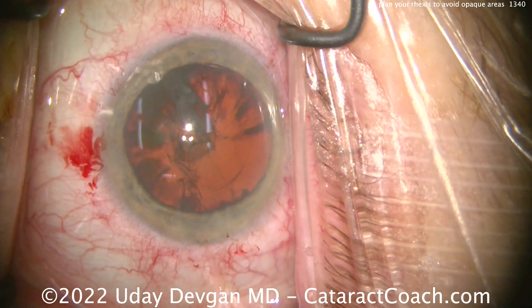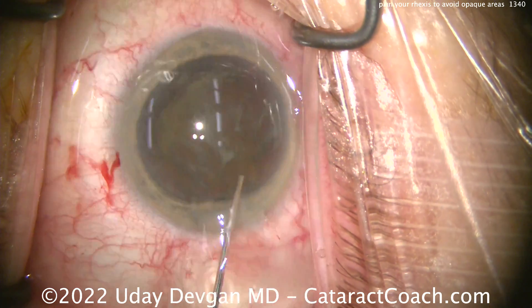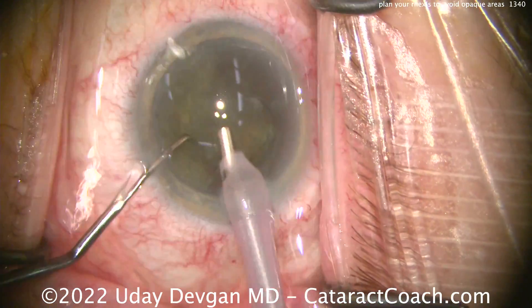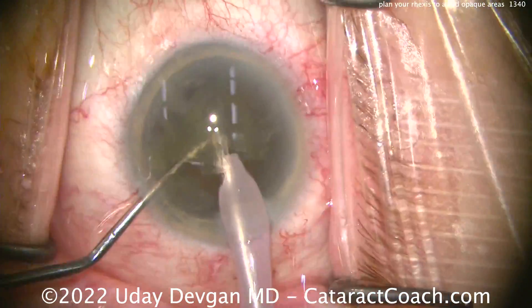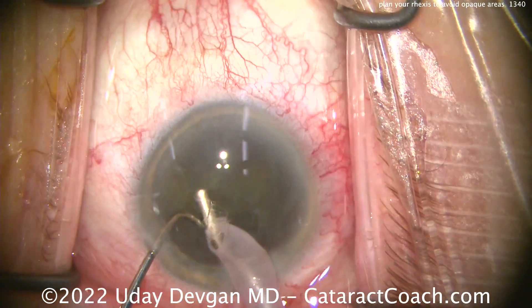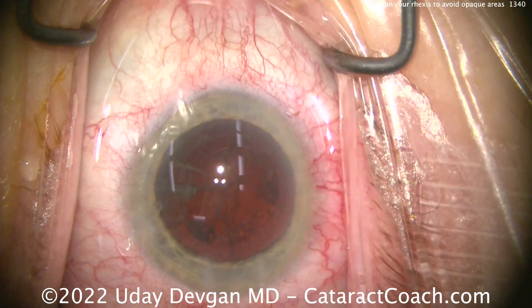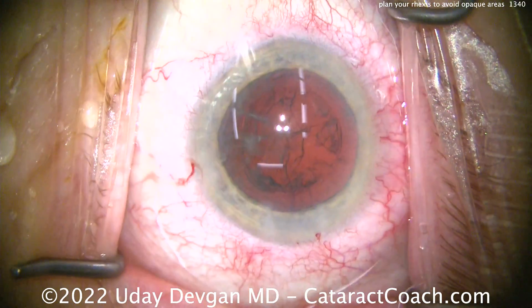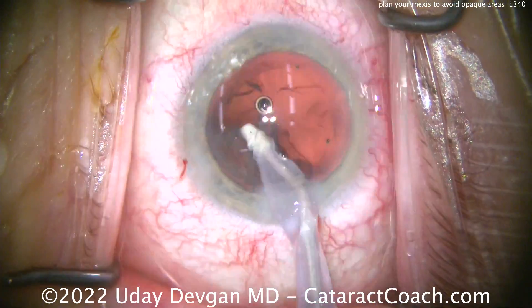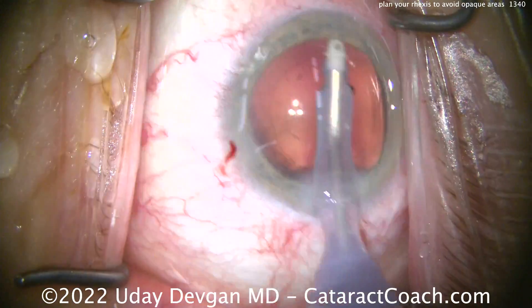Our international viewers are saying, why not just put some Trypan Blue dye in? I agree with you. Especially internationally, Trypan Blue dye is very inexpensive. But here in the U.S., you want to use it judiciously — it adds an extra step to the surgery, and it's $66 for a single dose or vial. That's for one patient. If you need it, for sure use it. But after about 5,000 to 10,000 of these surgeries, you realize you don't need the Trypan Blue dye all that often. I do what's best for the patient with the highest margin of safety — if I need it, I'll use it.